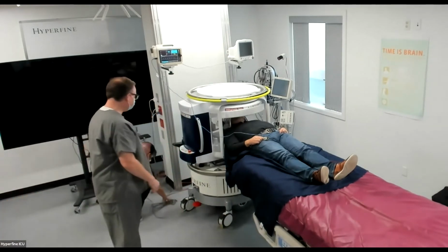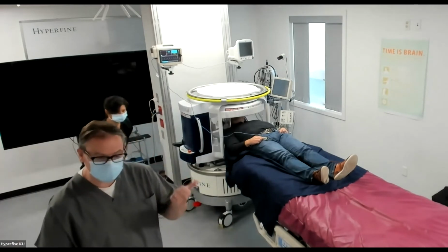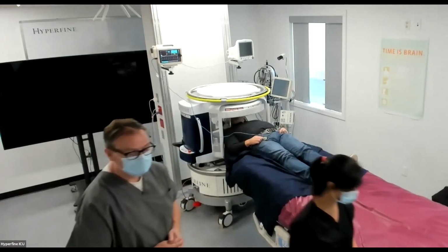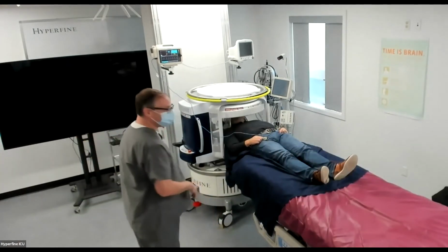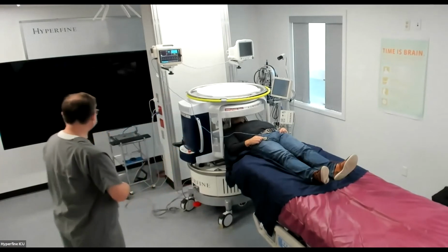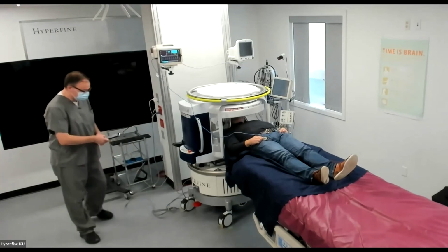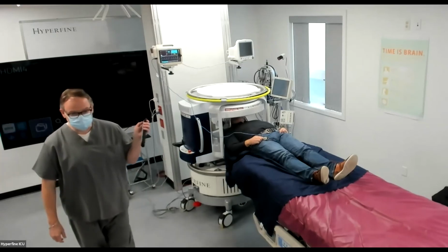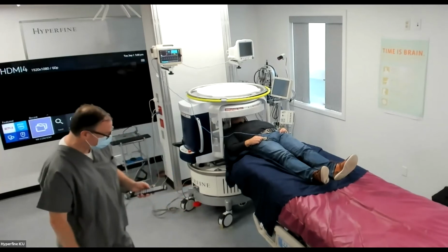Oh, yeah. One critical thing for Khan to take control, we need the Ethernet. We can connect to Wi-Fi as well at the hospitals, 2.4 gigahertz or 5 gigahertz. So now we're on the network. Khan should be able to reach the scanner. I'm going to go ahead and turn this monitor on behind us just to prove that we can have these electronics surrounding the scanner without any concerns at all of interference from them.